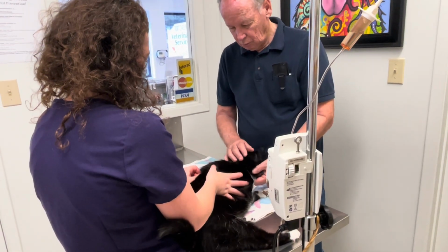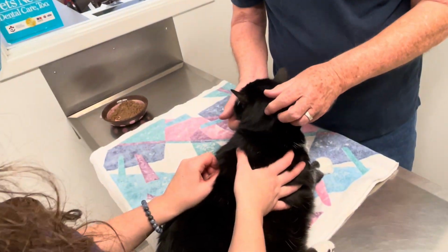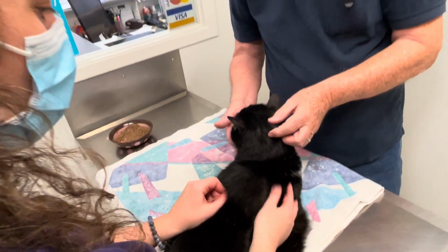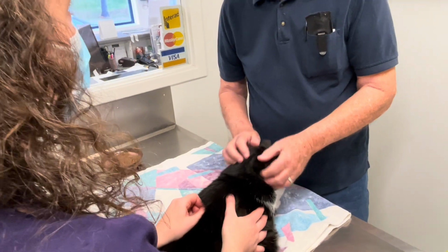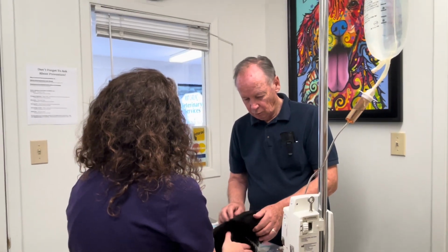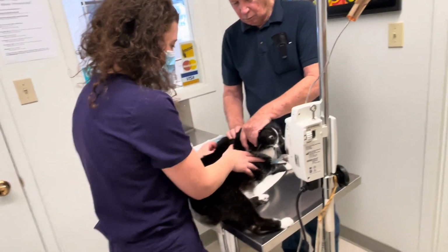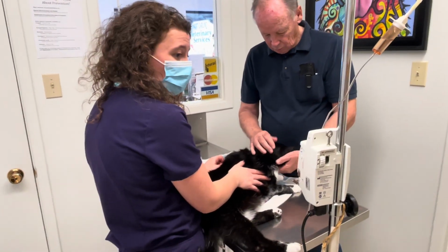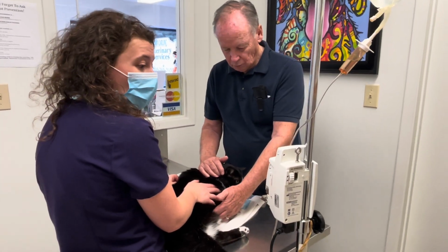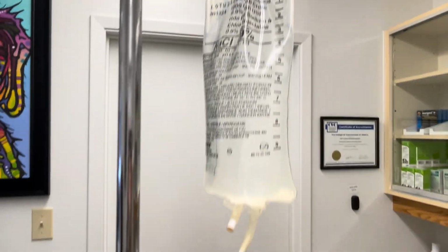So we can feel here now that some of the fluids are going in subcutaneously. We can feel that there is some swelling right here now, which is normal. It will start to settle. It can settle in many different ways, which is normal as well. But it'll probably just go into his sides here later on. So we just need to stay here for another few minutes. We can see that our bag is really going down here. And that we don't have too much more that we really need to be giving now.